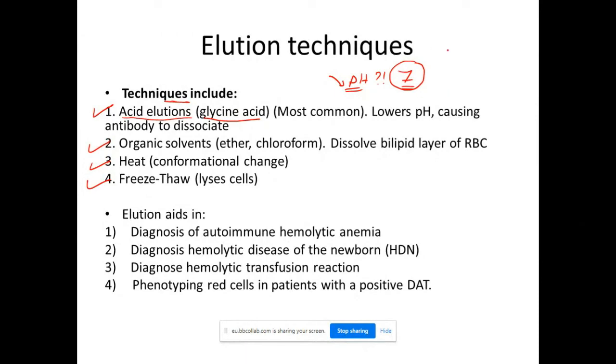And we know that pH is a very important factor for which step: the sensitization step, the agglutination step, or the bridge forming step? Can you remember? Yes, excellent. Noura said it's the first step. pH is a very important factor related to the first step. Physiological pH helps the antibody; we know that the antibody usually works at physiological pH. So if we provide this pH to the antibody, it will be able to bind to the antigen.